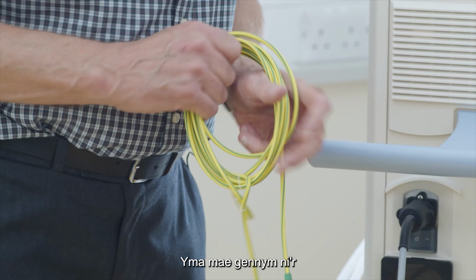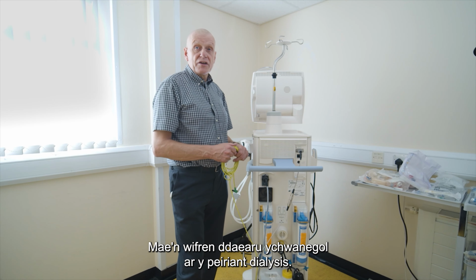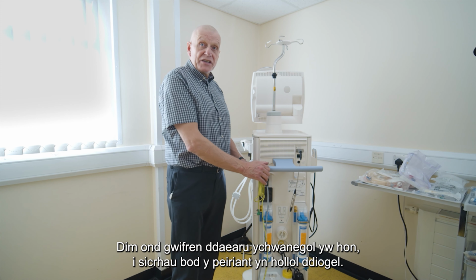Here we have what's known as the equipotential bonding cable. It's an extra earth on the dialysis machine. The machine does have its own earth, as you would in any electrical appliance. This is just an extra earth to make sure the machine is doubly safe.